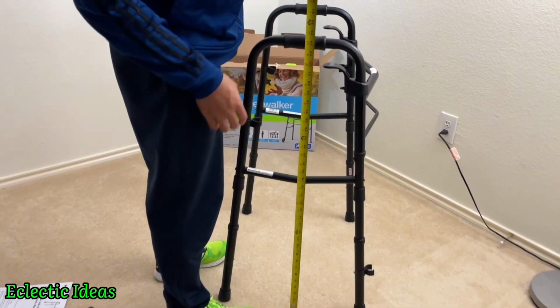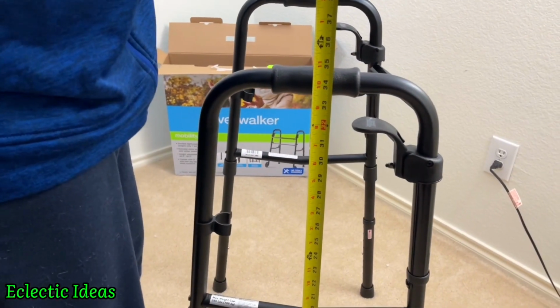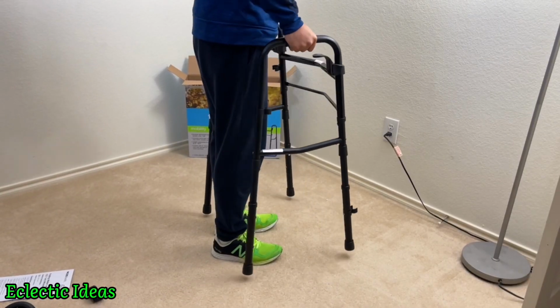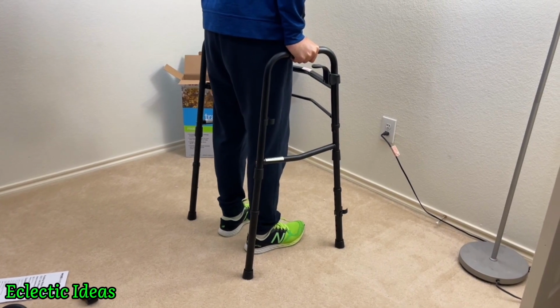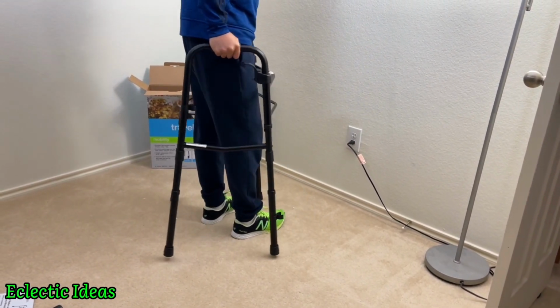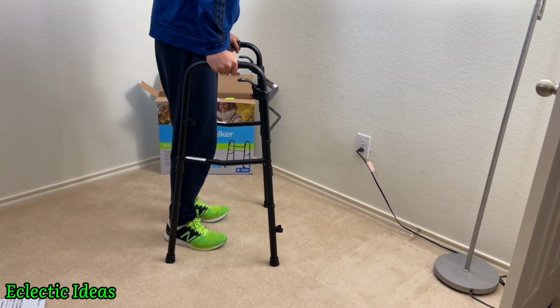The halfway marker is about 34.5 inches tall. So this guy's a bit over 5'9". 5'9" works for the halfway setting. It's much more stable than the fully extended legs. Without the wheels and with the glides on, it can be used much more like a crutch. You can lean more on it.